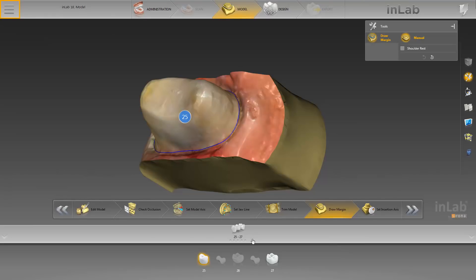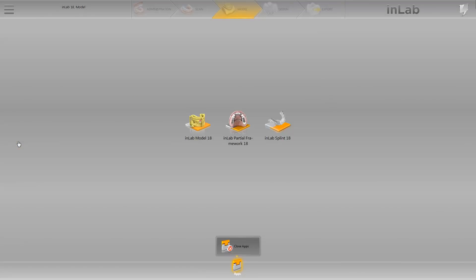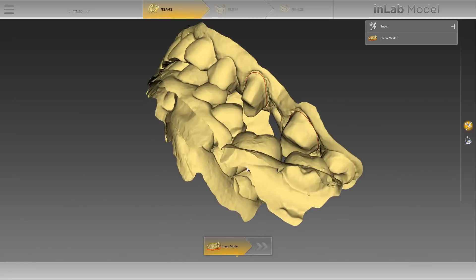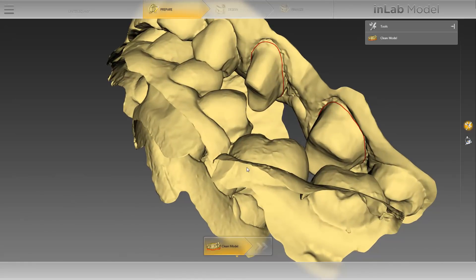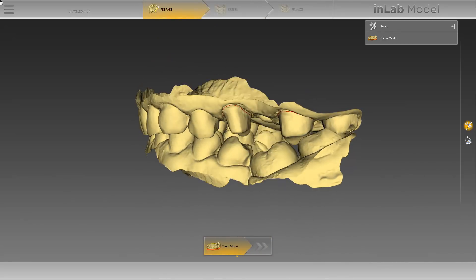We open the system menu and click on option apps. By clicking on the option InLab Model 18, the app will open as a separate application. First, we will look at the 3D model and can easily see the preparation margin shown in red. In this module, there are 3 phases, and depending on the phase you are in, you will have access to different tools.